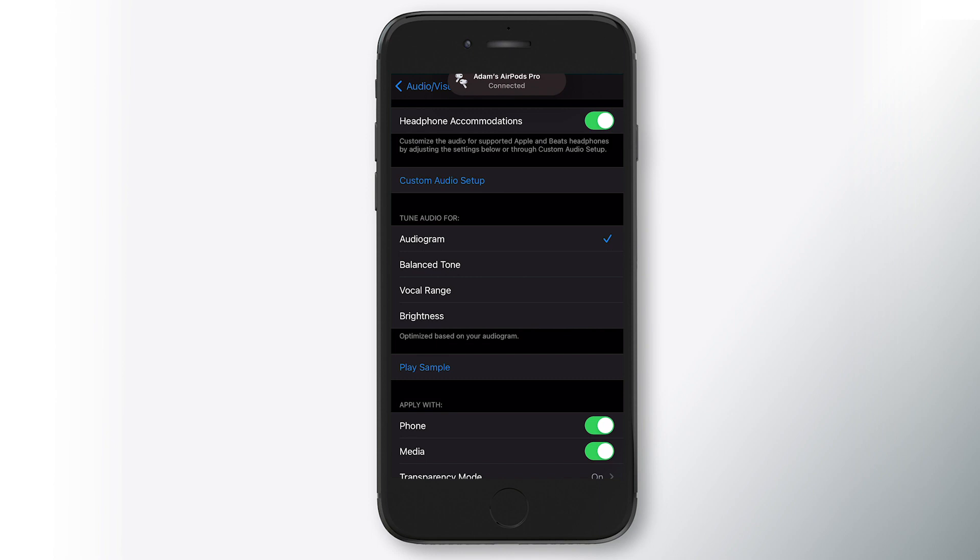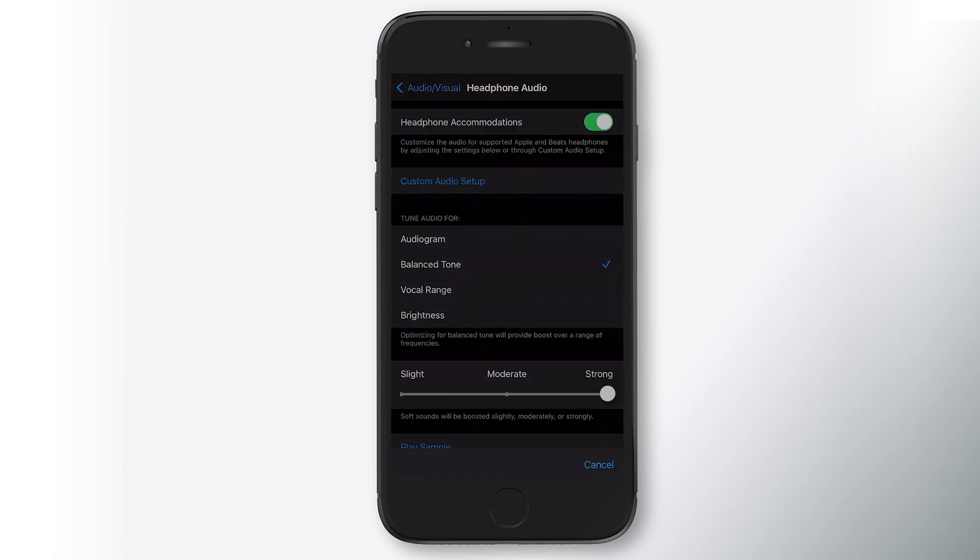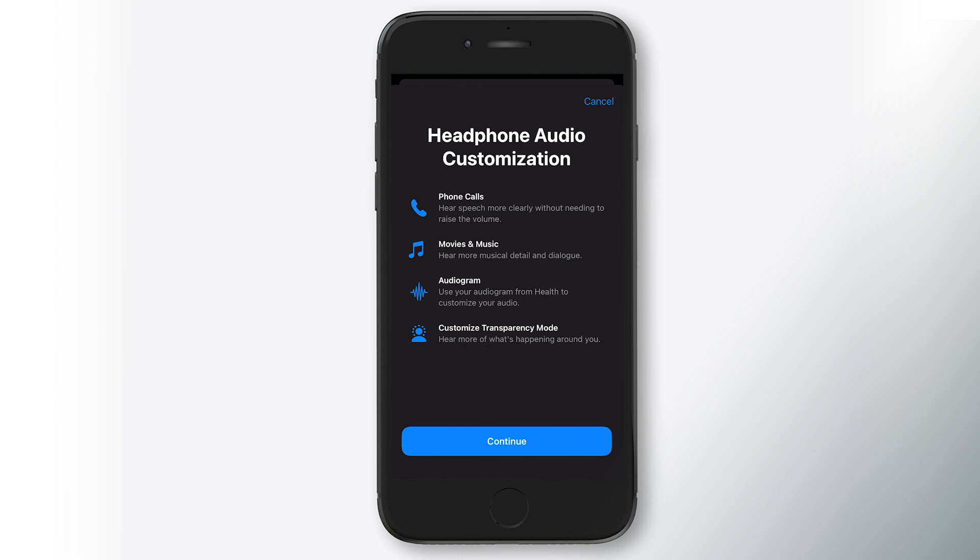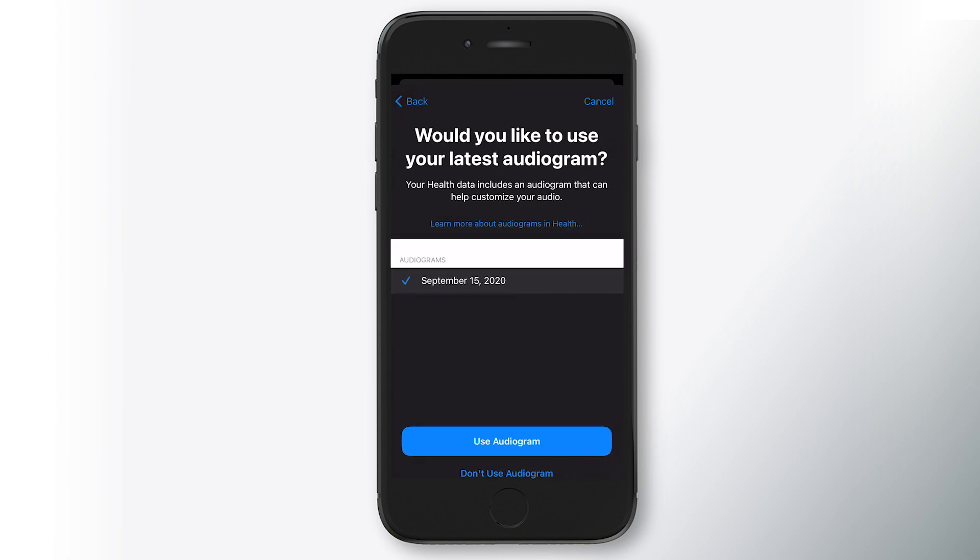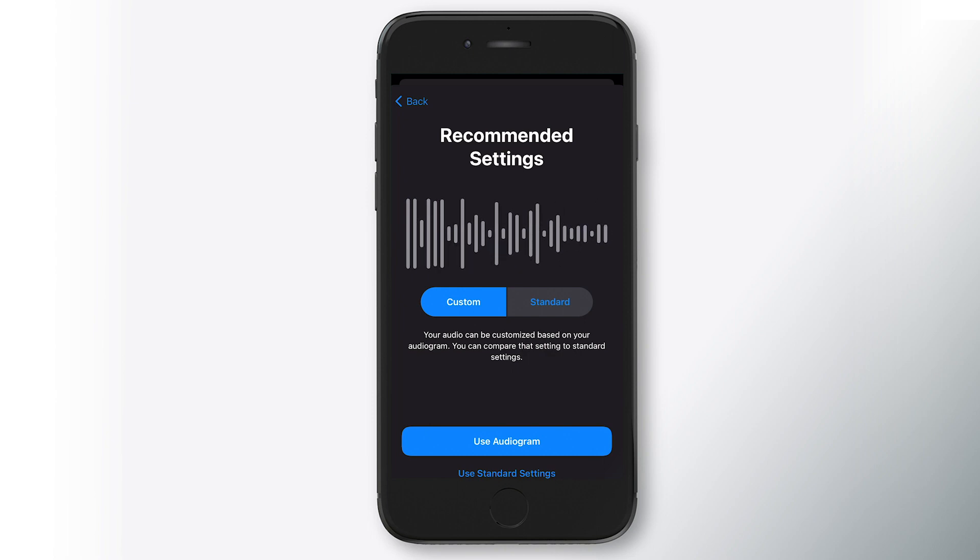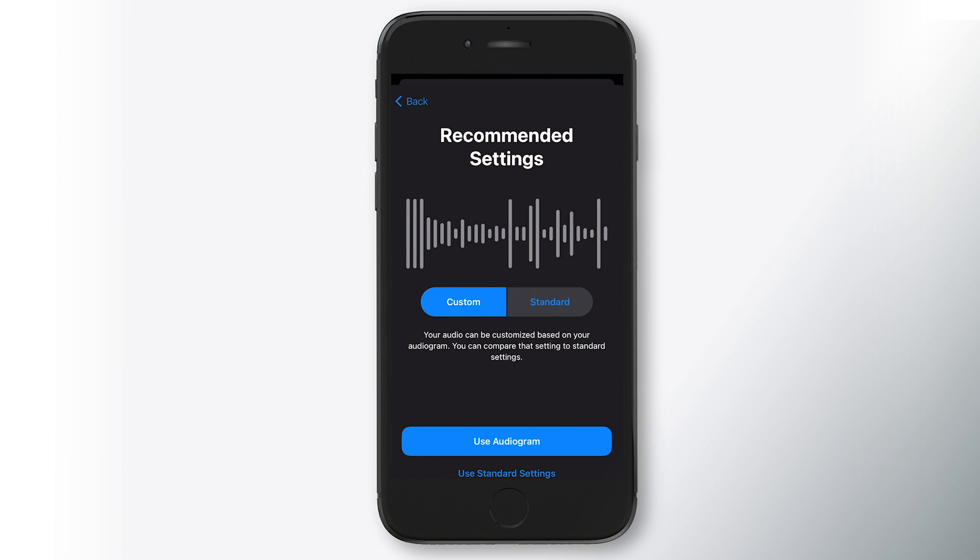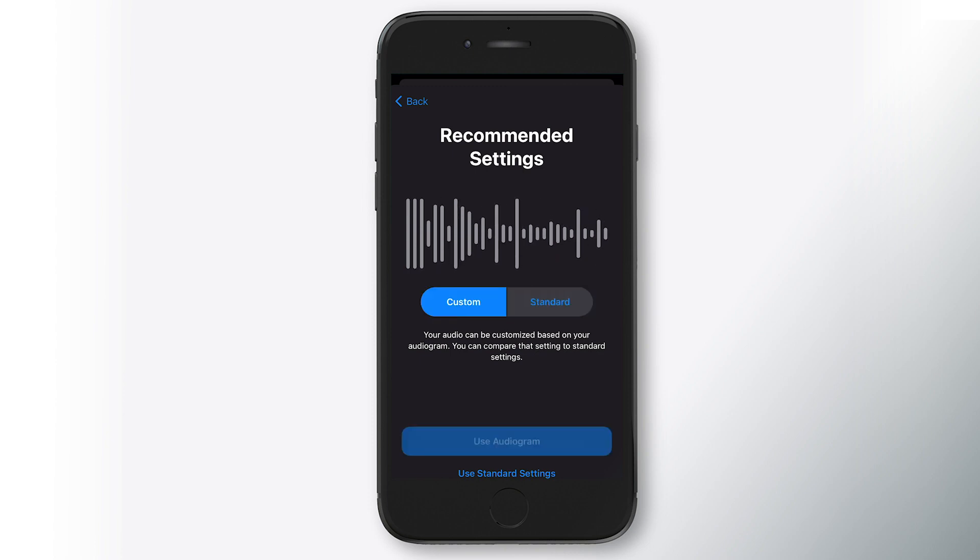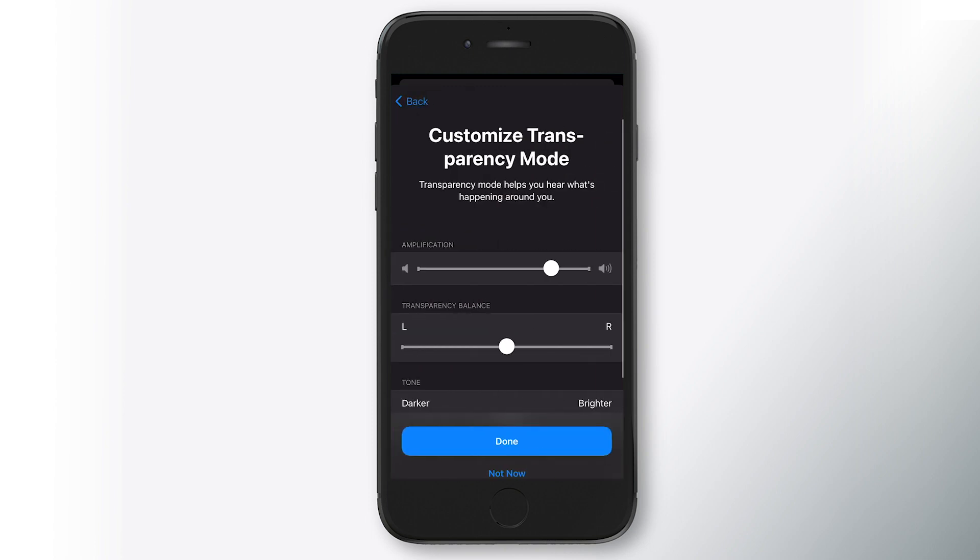So now they're in. I'm going to go through custom audio setup and it's going to ask me some questions. So I'm going to continue and it's going to ask me, would you like to use your latest audiogram? And here it's asking me to select between what I'm hearing with my audiogram settings versus the standard settings. We're going to choose use audiogram.